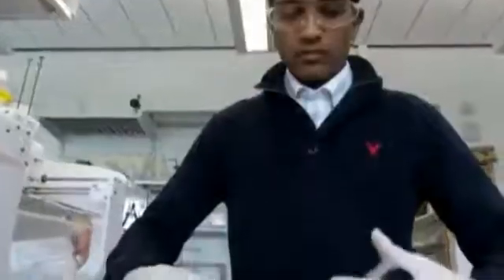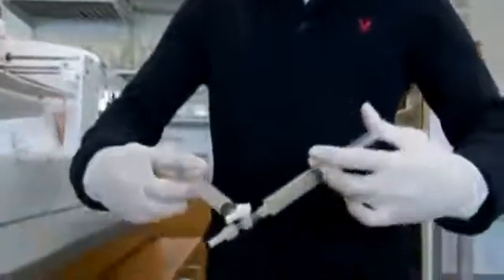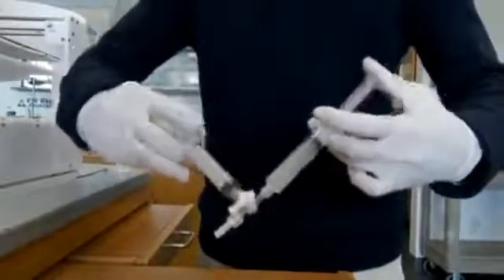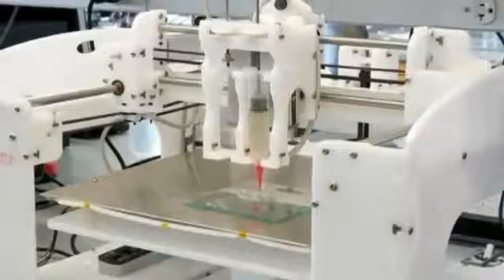And with time, our implants start out as cells suspended in a gel and turn into cells suspended in tissue, just like normal cartilage. Although the printable ear hasn't been tested in humans, samples have been successfully implanted on the backs of laboratory rats. The biggest technical challenge, however, is generating the number of cells needed for the process. Just one implant requires 250 million cells.